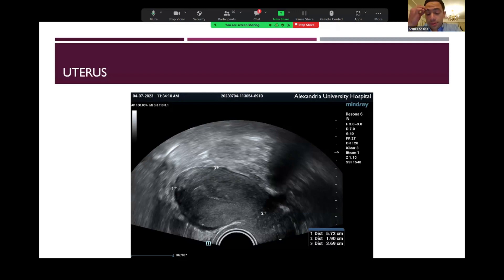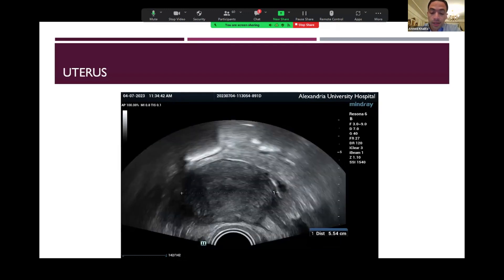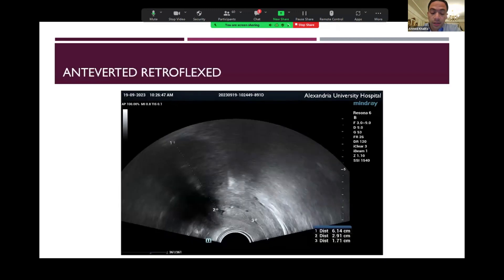We will start with the uterus and take its dimensions in three dimensions: the uterocervical length, the anteroposterior diameter, and the transverse diameter. This is important to diagnose any signs of adenomyosis or any globular enlargement of the uterus. Also, the presence of an anteverted retroflexed uterus is a very important sign that may increase the suspicion that there are adhesions at the back of the uterus and at the pouch of Douglas, retracting the body of the uterus backwards.